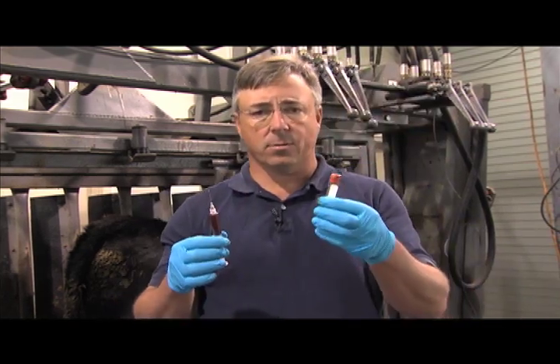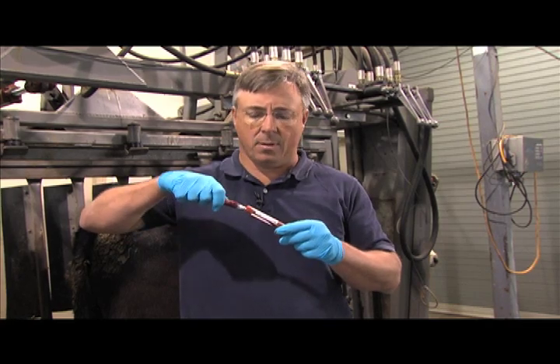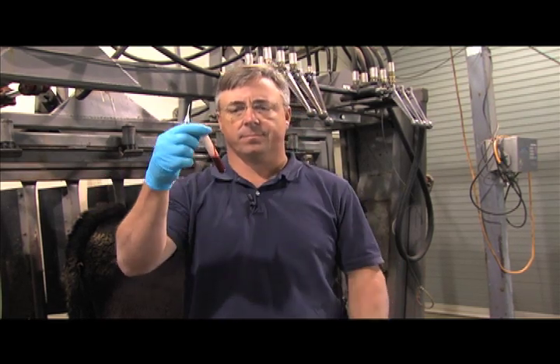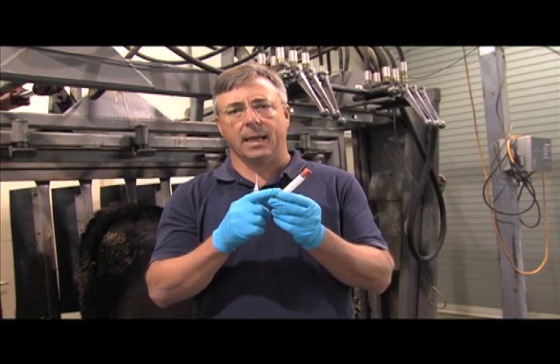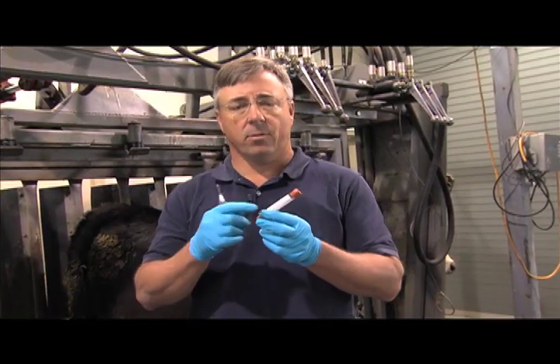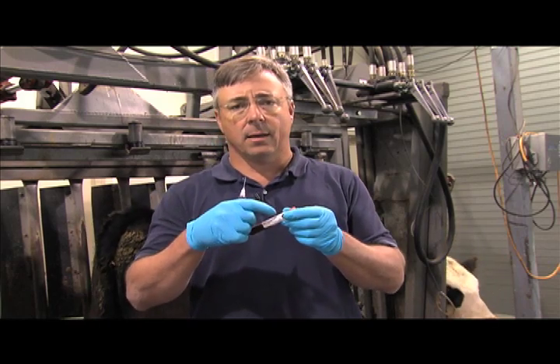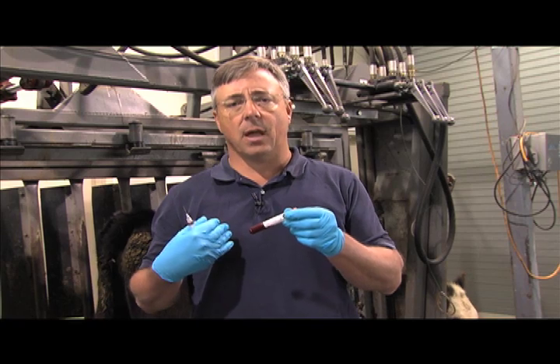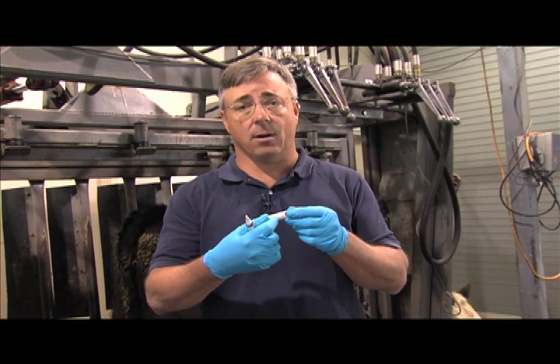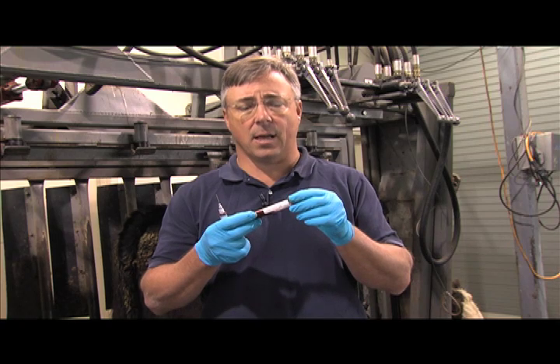Once you've taken the sample, you'll take your tube that the sample will be sent to the company. You'll insert the needle, and the vacuum from the tube will evacuate the blood from the syringe. Make sure that the tube is accurately labeled with the sample number. So if this was the first animal that we did, it was sample number 1. With the cow's identification, this cow is Z24. So we will write sample 1, cow Z24. And then this is from the UK Research Center. So I would put some indication there that it's UK Animal Research Center, UKARC, something like that, so that the blood sampling company can accurately track which farm, which sample, and which cow.